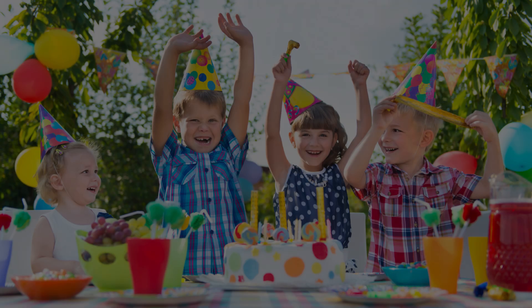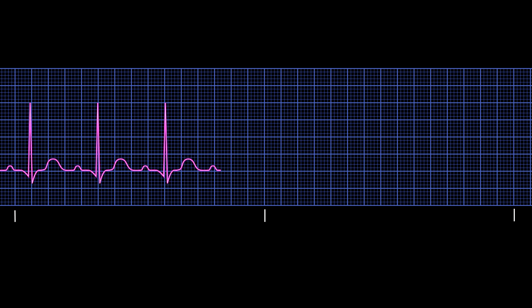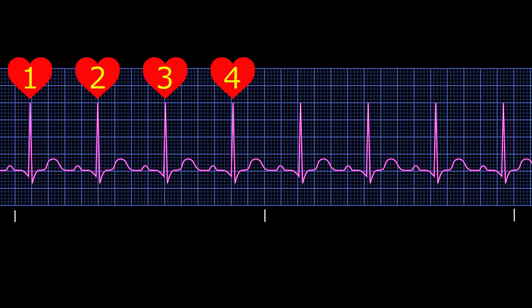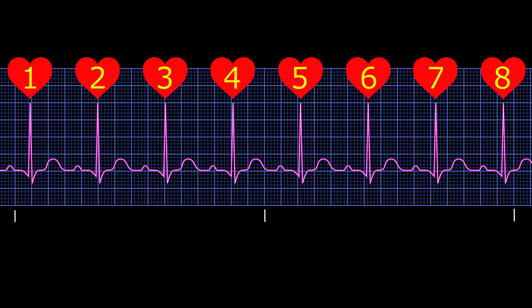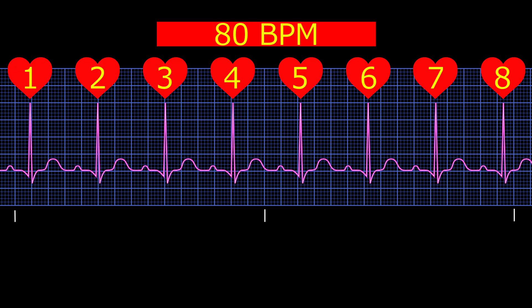Let's do another one just because this is so much fun. How many beats in this six second strip? 8 beats times 10, the heart rate is 80.